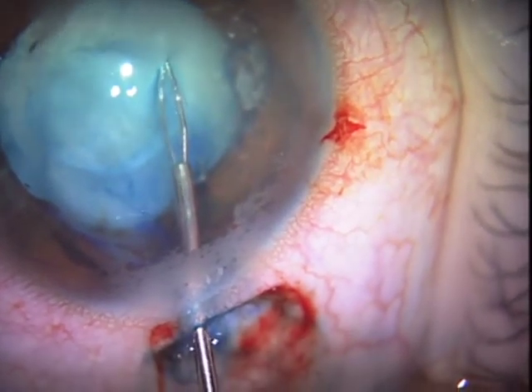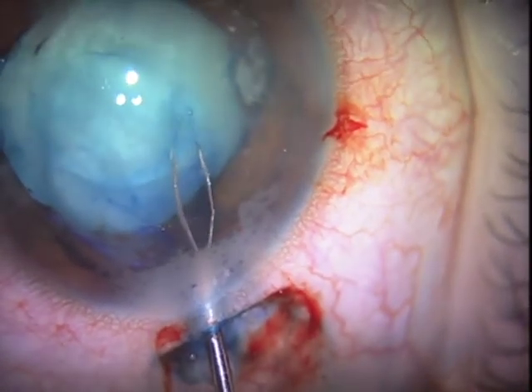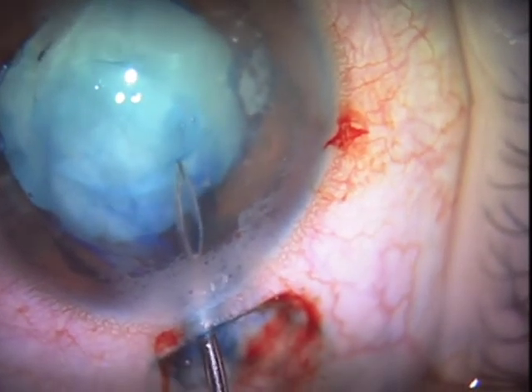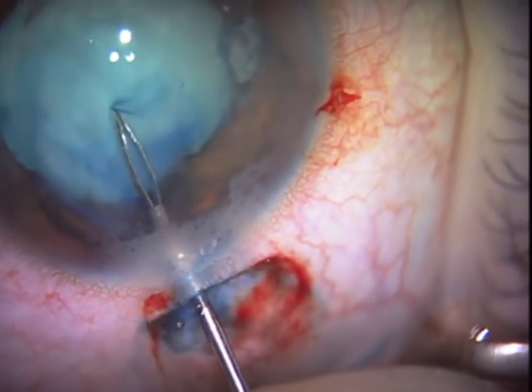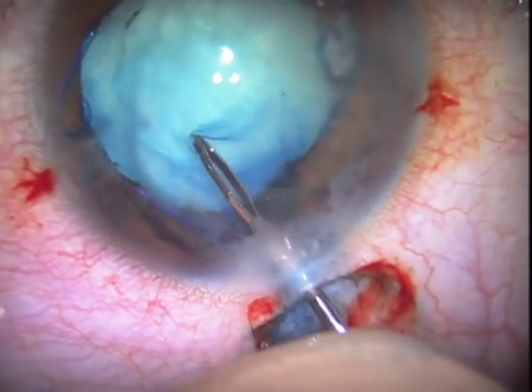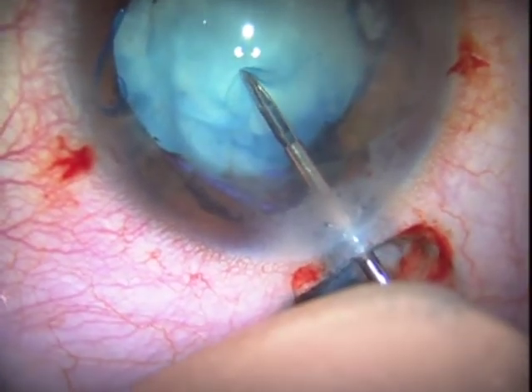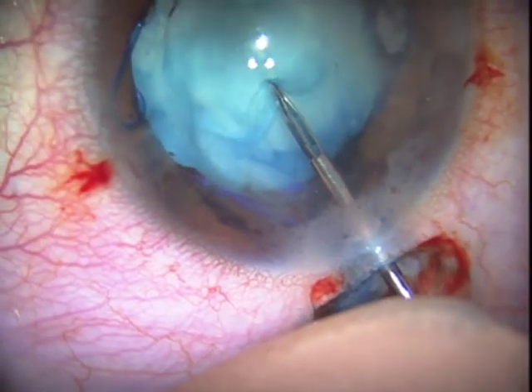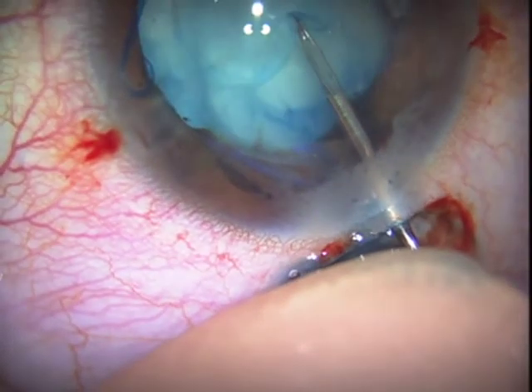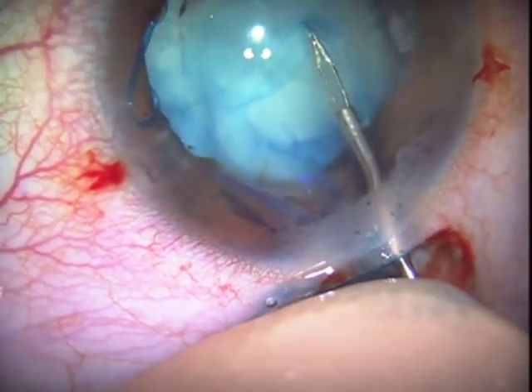I've also found that quite often the fibrotic element is within the central four millimeters or so of the capsule, and if one just makes the capsule opening larger one can get around the fibrotic elements. Other times the fibrotic bands can go out to the equatorial area. We're fortunate we haven't run into any fibrotic band and we're getting near the starting point of the CCC.